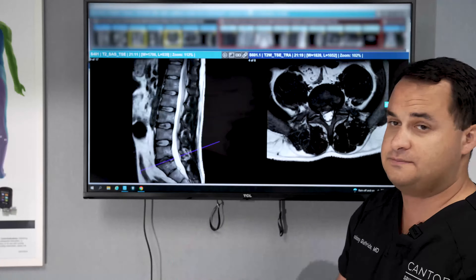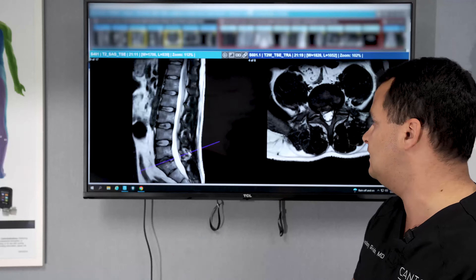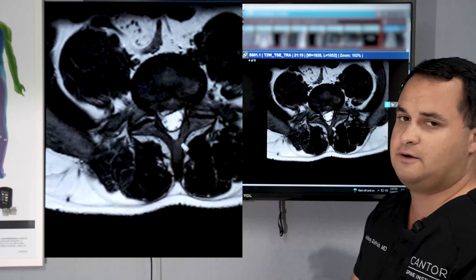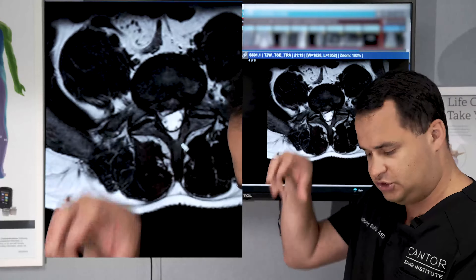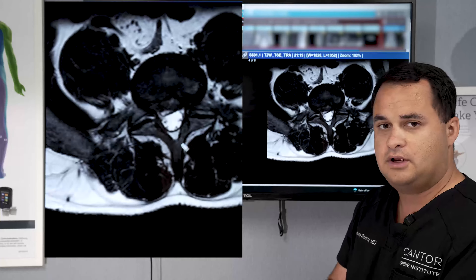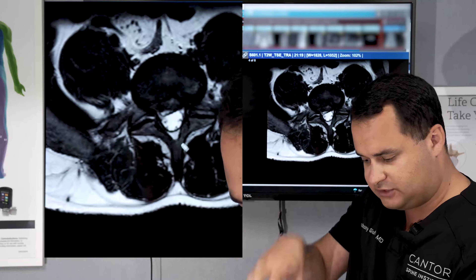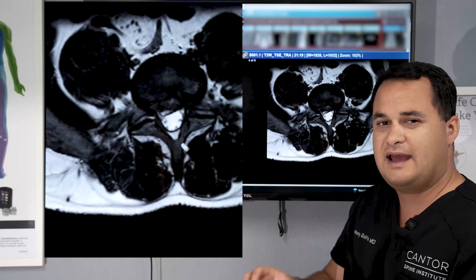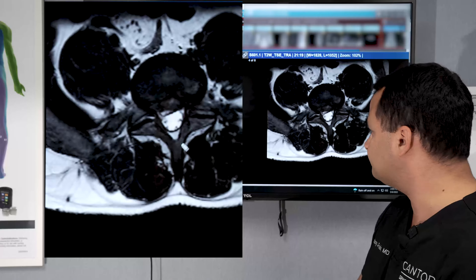Remember, this patient has pain on the right side. So we come over to the axial view — I tell patients this is like looking straight down, cutting them like pancakes and looking straight down, slice by slice, all the way down at their spine.